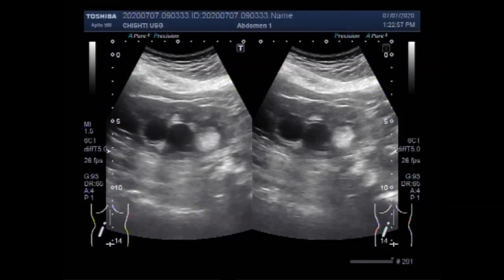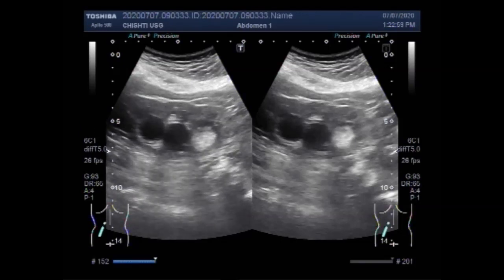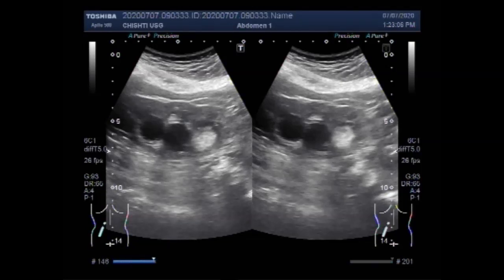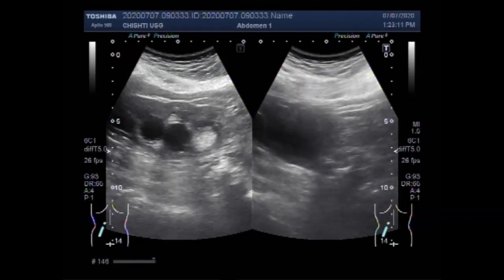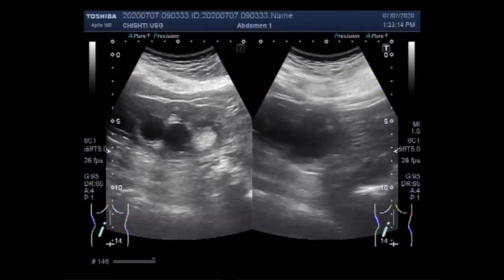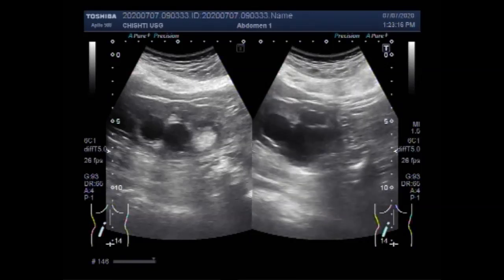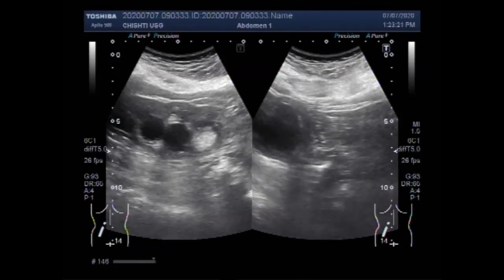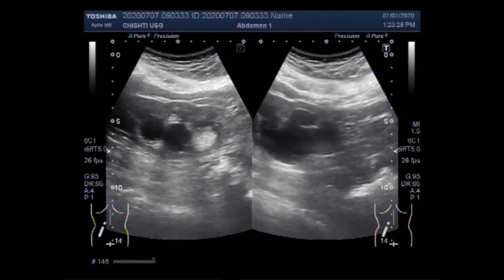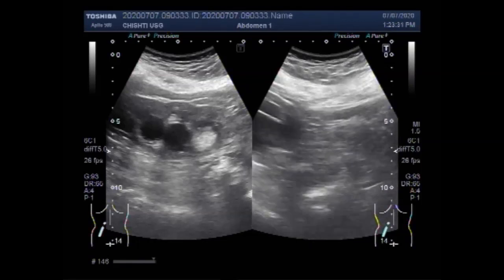Now you can see this mass measures about 19.0 millimeters by 18.3 millimeters. The kidney shows moderate to severe hydronephrosis with hydroureter, and this is a stone in the ureter. You can see the stone.